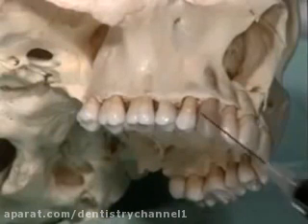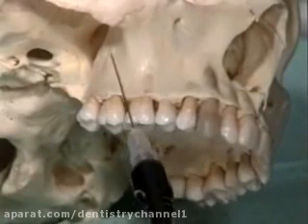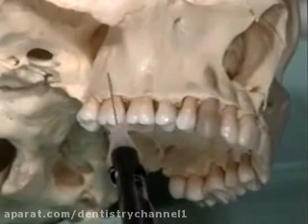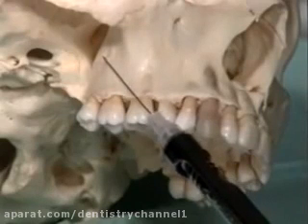If the insertion point is too anterior or too close to the alveolar process, or if the angulation is too vertical or too medial, premature contact with bone will occur. In these situations, the needle should be withdrawn and correctly repositioned for a new straight insertion.